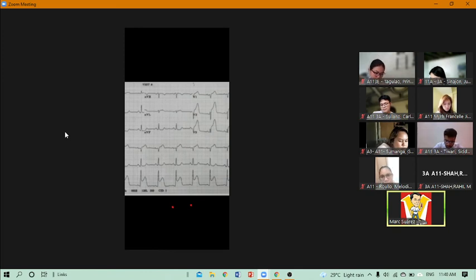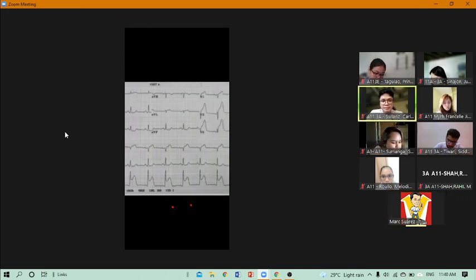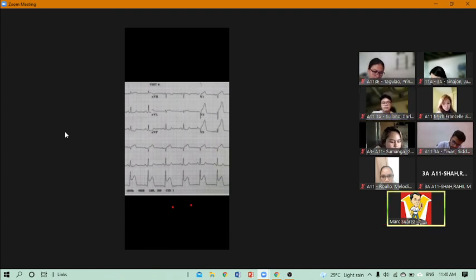The criteria for the limb leads is different from the precordial leads. Okay. Then assignment number 2 is where do we get the factor 1,500 and or the 300?